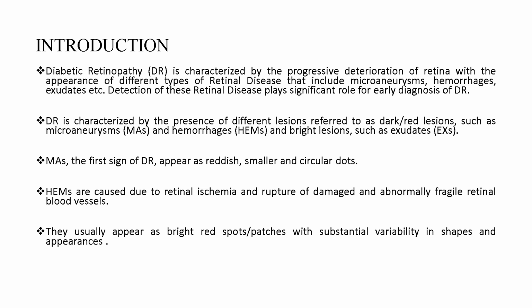As a result, measuring the retinal layer thickness is useful for early diagnosis and determining disease progression in order to develop an effective treatment plan. Layer thickness is measured using a segmentation procedure. Hence, layer segmentation is important for diagnosis and treatment planning. While human segmentation takes time, the automated techniques allow for the diagnosis of a huge number of photos.